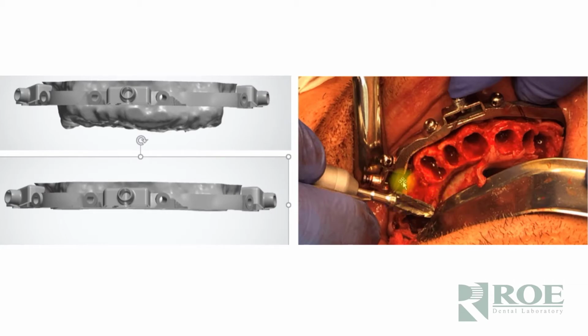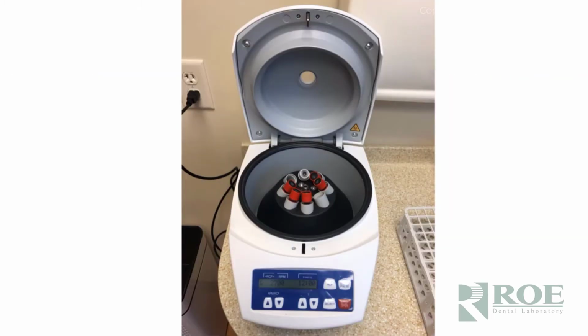A lot of doctors will also adjust the labial and the lingual of this ledge so that there's no sharp angles behind the tissue. That's another important tip, especially if you have sharp angles, because that will cut the tissue. It'll be a source of irritation and perhaps even pain or worse as the patient recovers. In this case, the doctor spun some blood.